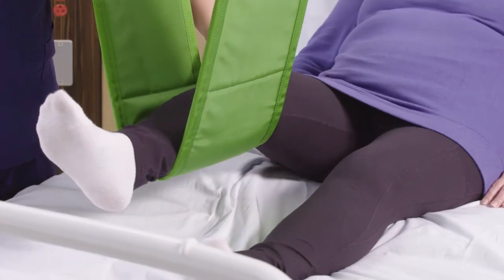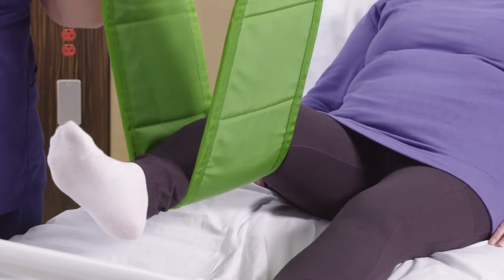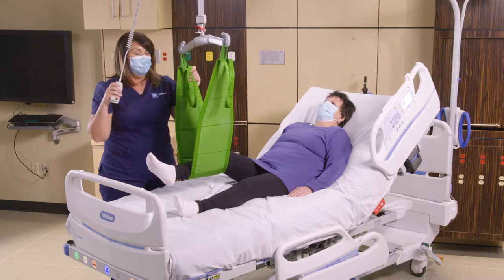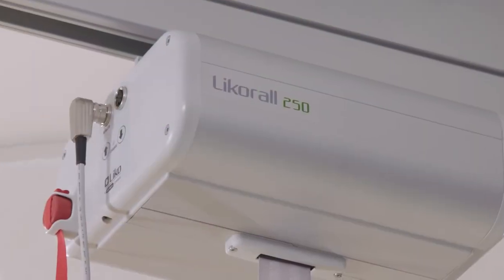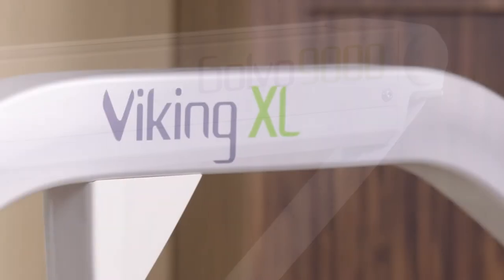This is great for wound care, dressing changes, and a bunch of other activities. It's also good for basic hygiene activities as well. The Multi-Strap is interchangeable and can be used on our overhead lifts and our mobile lifts including our Golvo and Viking.